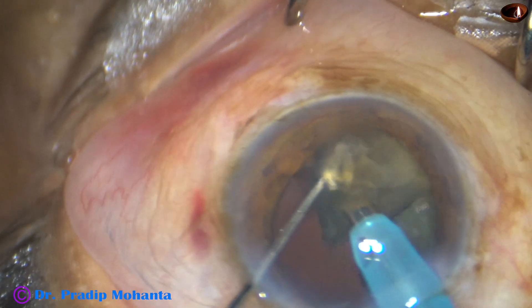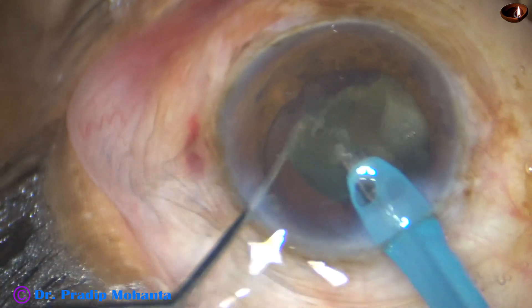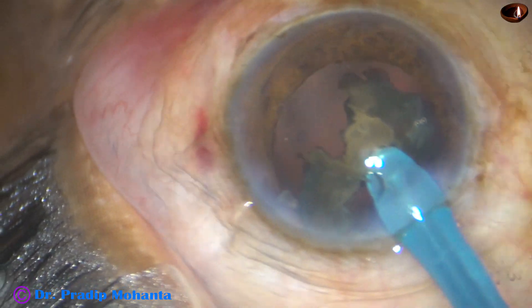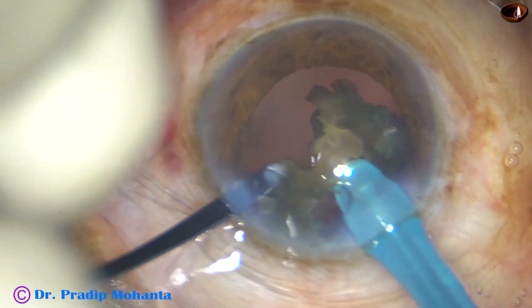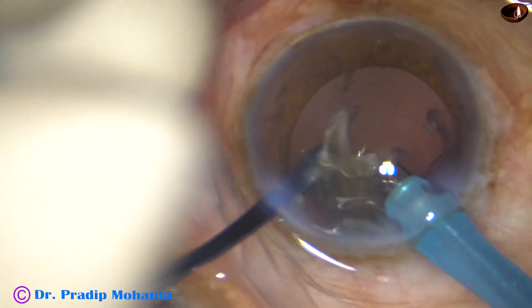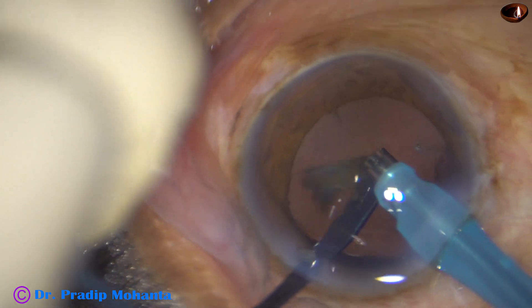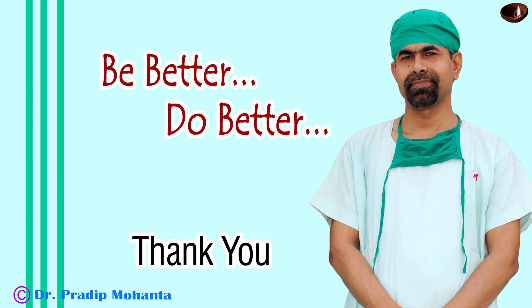Now, in this case I noticed that the posterior capsule is tending to come forward — it is tending to come near the phaco tip. My plan is to use a thick instrument which can protect the posterior capsule better than the chopper, and which has a curvature conforming to the curvature of the posterior capsule. You get a lot of room above it. This thick instrument protects the posterior capsule much better — it is blunt on all sides. With full protection, the last piece is emulsified. Thank you very much for your attention. Hope this video will be helpful in your practice.